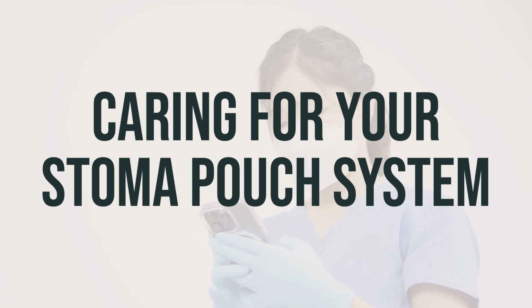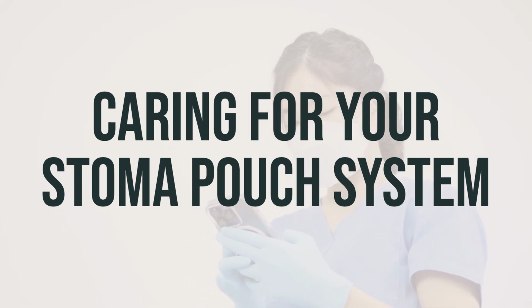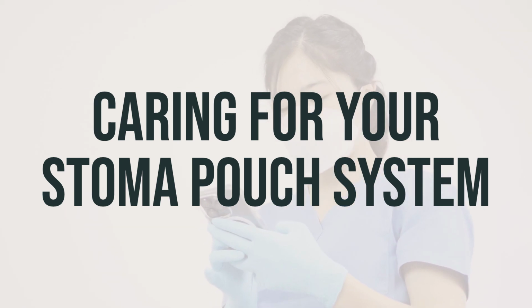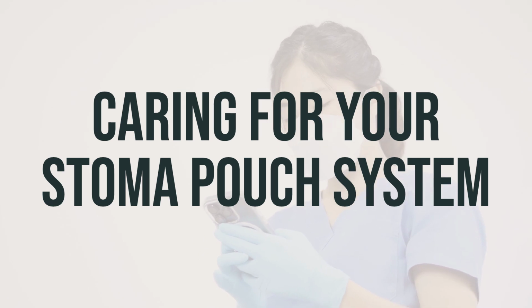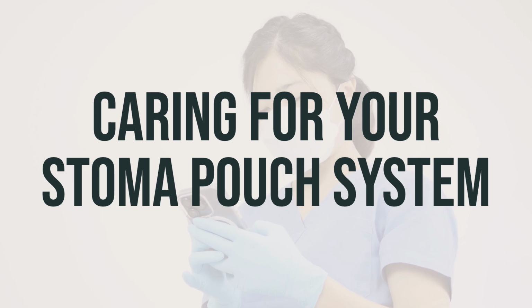To care for your system, it's important to empty your pouch before it gets too full, usually when it's about a third or half filled. It's also important to change your pouch system, including the skin barrier, every 3 to 5 days. If it leaks, be sure to change it right away to avoid skin irritation. Consider emptying your pouch before bedtime to prevent it from filling with gas overnight.